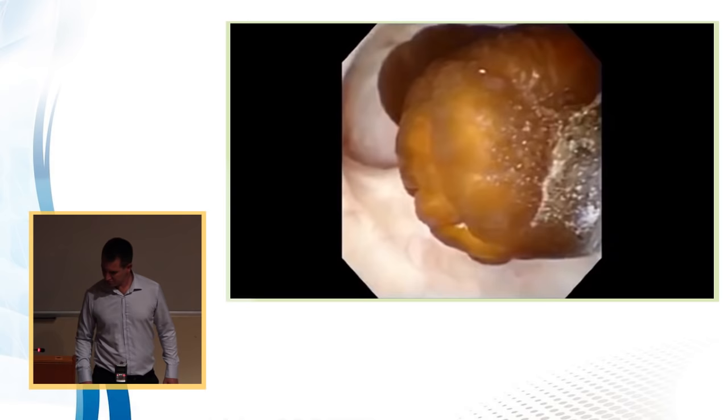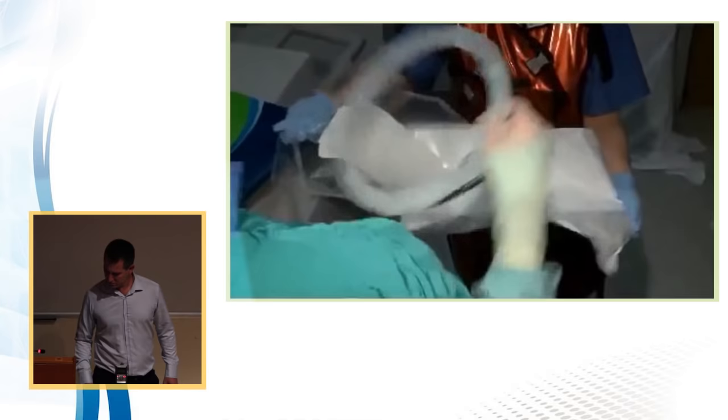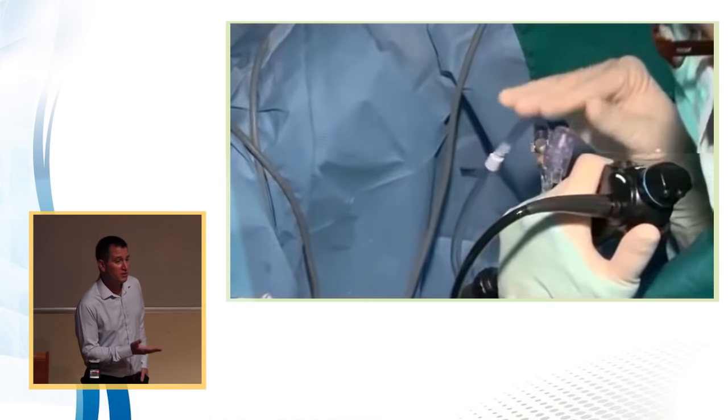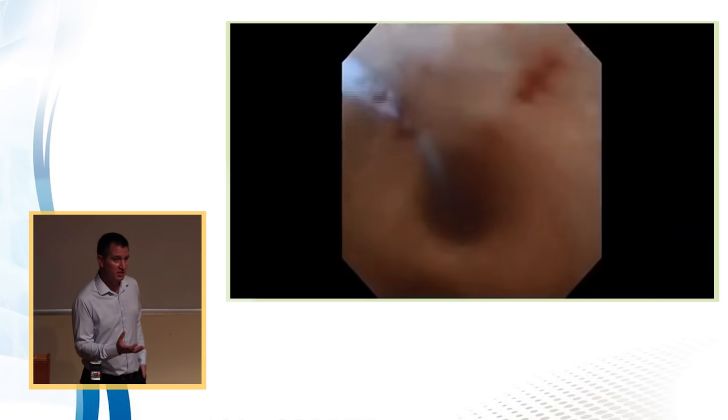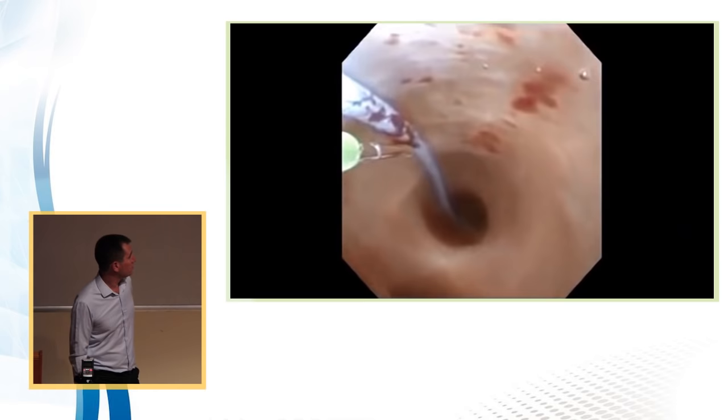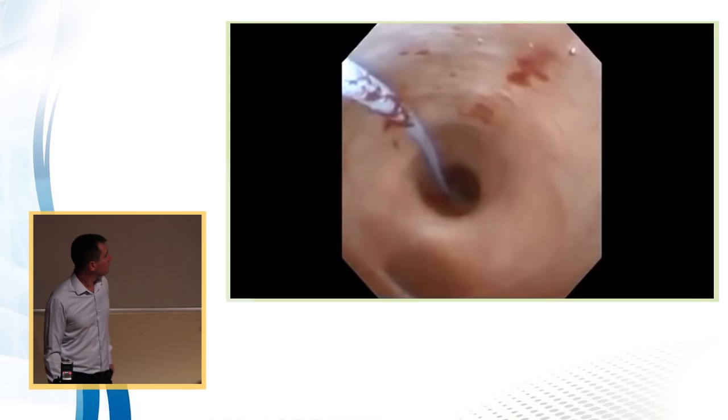When you do intrarenal laser lithotripsy, we invariably use a 200 micron fiber. Because by setting different parameters for the laser, we can control how we fragment the stones, if we do a fine fragmentation or if we use high energy to break it into small parts and then fine fragmentation. And there are a few techniques that are discussed in the literature and in the conferences, how to do it efficiently.